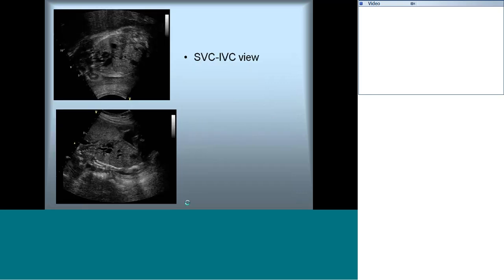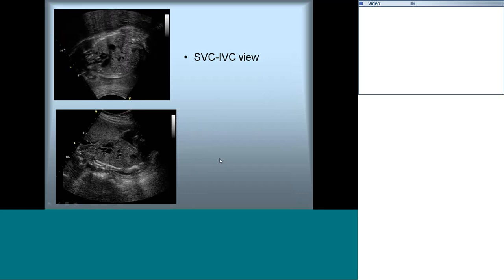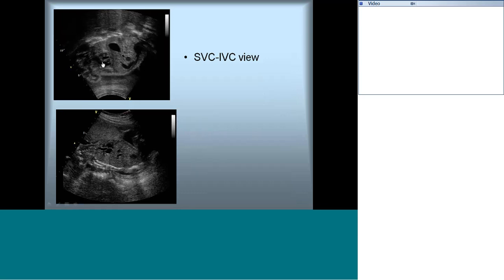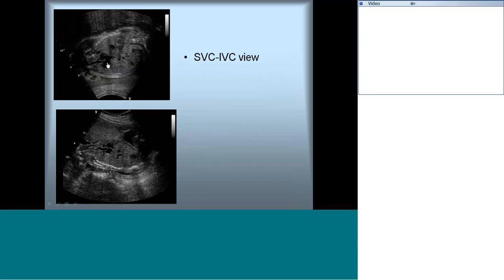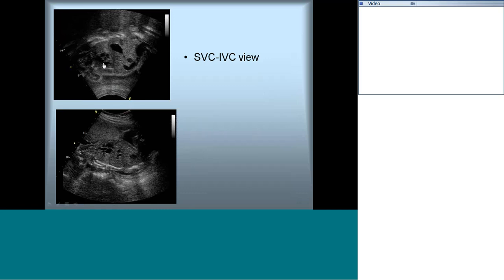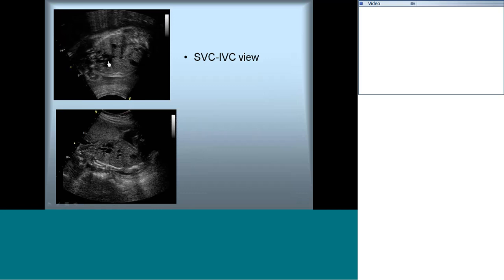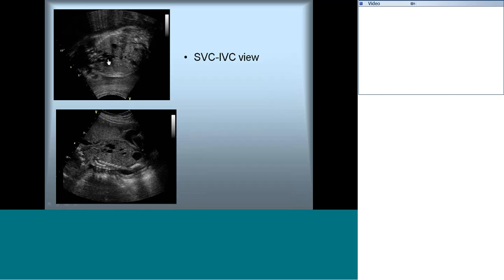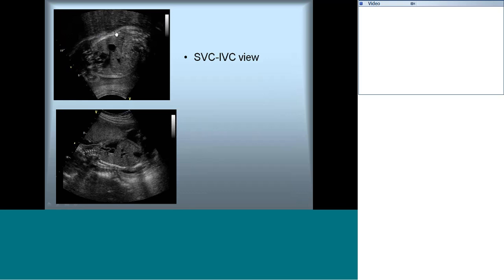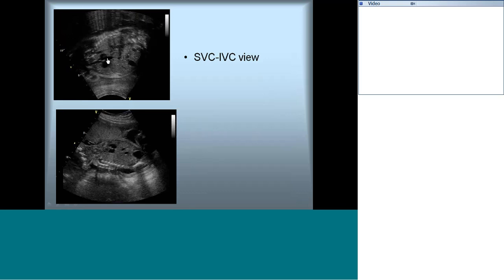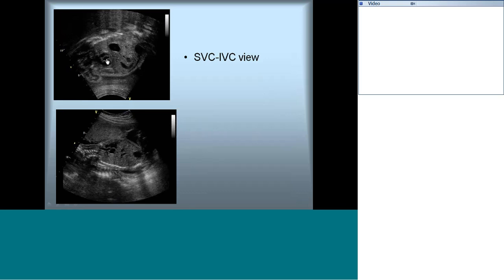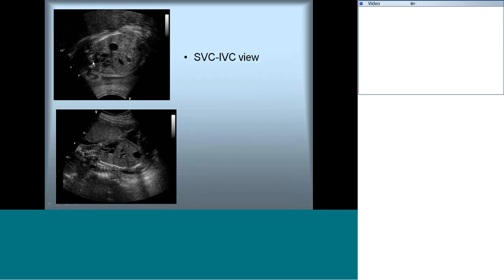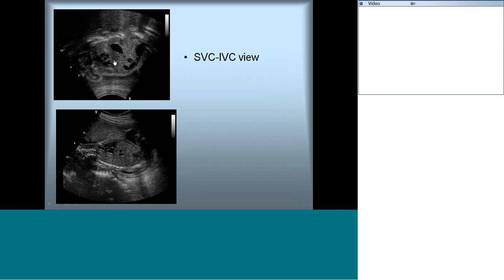From this view, sweep across the sagittal plane of the body to get a sagittal cut of the heart, similar to our subcostal sagittal view. This opens up the SVC and IVC draining into the right atrium. The posterior atrium close to the spine is the left atrium. You can see the flap entering into the left atrium, confirming that atrial situs is okay and systemic venous drainage is normal.